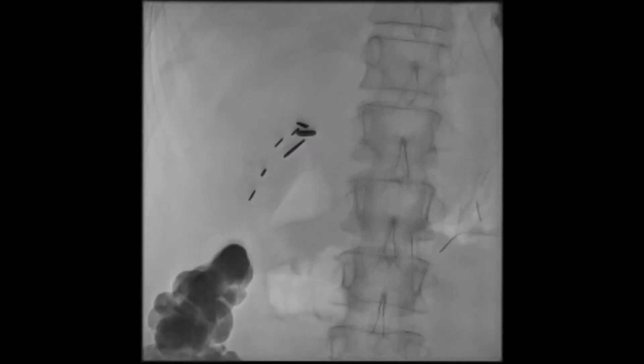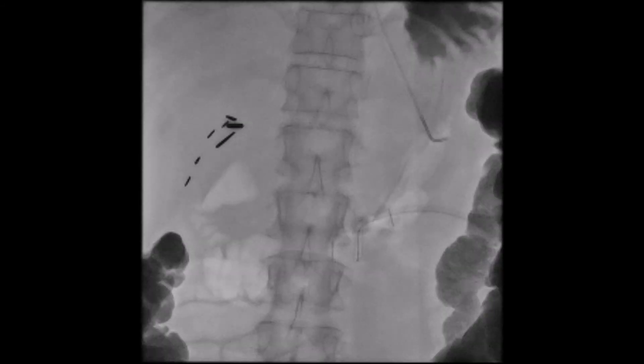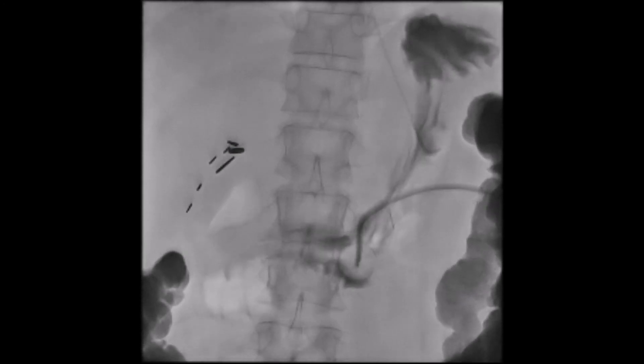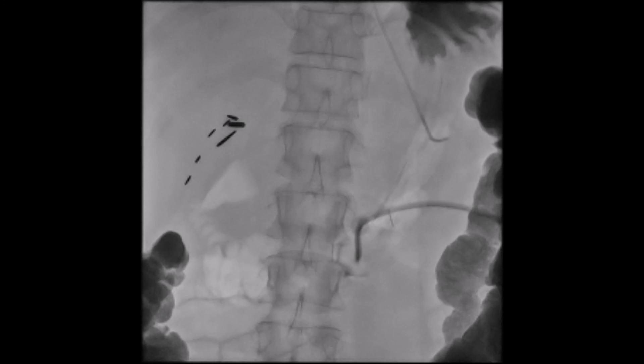In the video, you have to look closely, but you should be able to see the gastrostomy tube balloon getting pulled back against the wall of the stomach. Here's another video of me pulling back on the gastrostomy tube before securing the disc down to the skin — you should be able to see the balloon between the two T-tacks. This is my last procedure clip, played first at slow speed then in real time: I'm injecting contrast through the new G-tube. Contrast fills the gastric lumen, you can see rugal folds and contrast outlining the G-tube balloon. We've taken many steps to confirm position in the stomach lumen — this final contrast injection is, in my opinion, the most important shot to clearly document appropriate G-tube position.